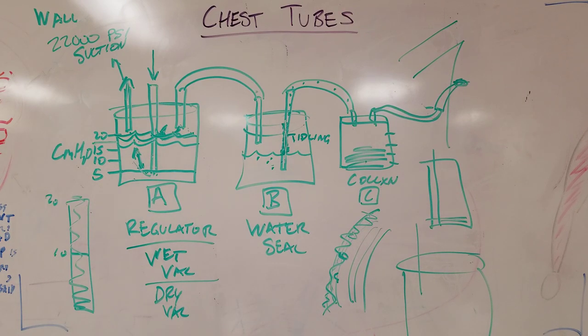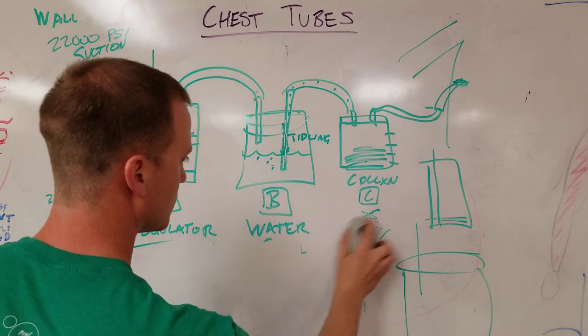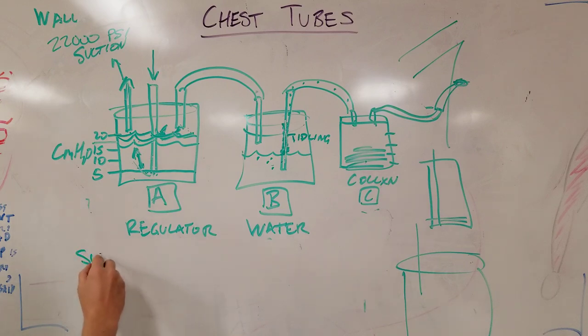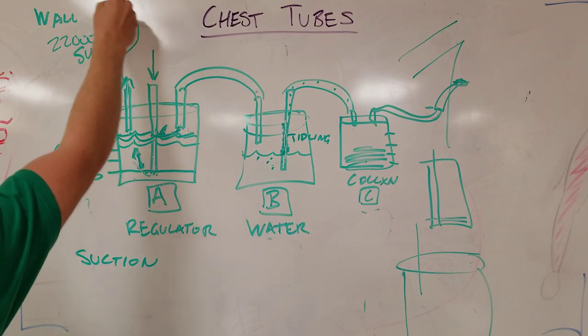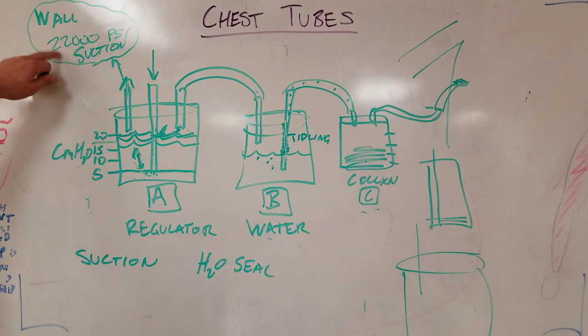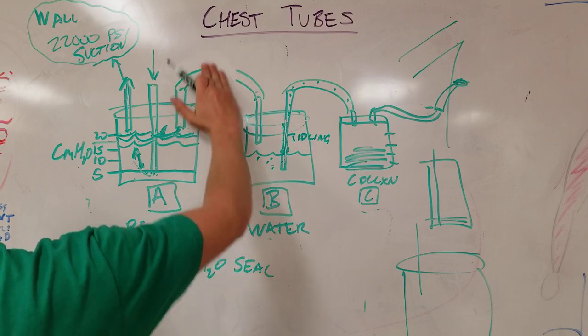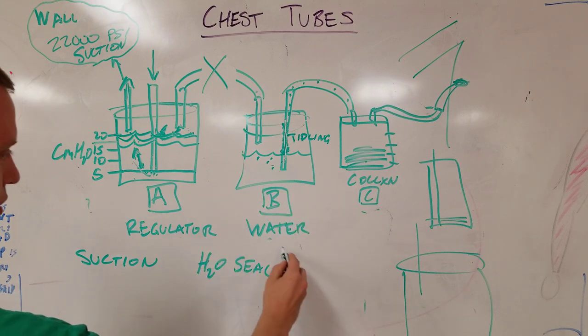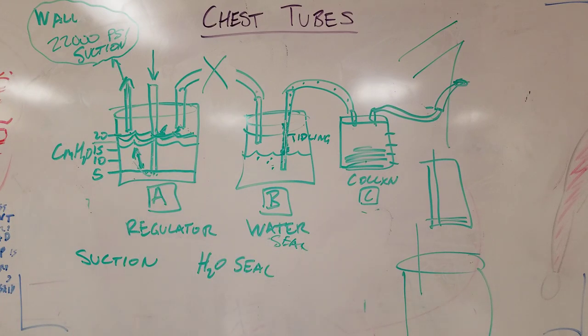Now, a couple things. If all this system is open and it's hooked up to wall suction, the way that I would describe this system is, a chest tube can be a couple different things. It can be to suction, which is what it currently is, right? We're to wall suction. It can be to water seal. And what that means is we take off the wall suction. So they're still carrying around a chest tube, they're still carrying around a pleurovac, but essentially we're stopping the circuit right here. That's a water seal. You're not clamping anything, you're just unhooking the suction tubing. What that means is the patient still won't get an air leak because they still have their water seal, but there's no suction. So the patient's chest has to stay inflated on its own. It's not getting any extra suction help.